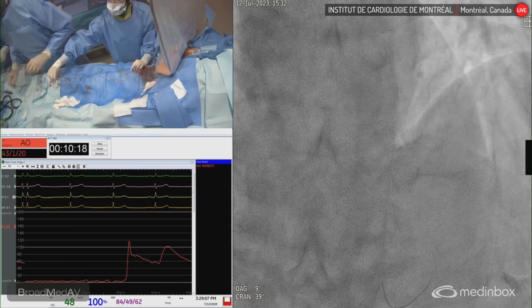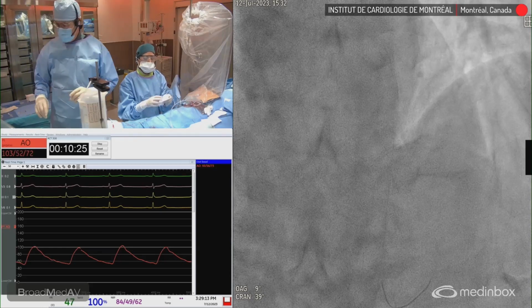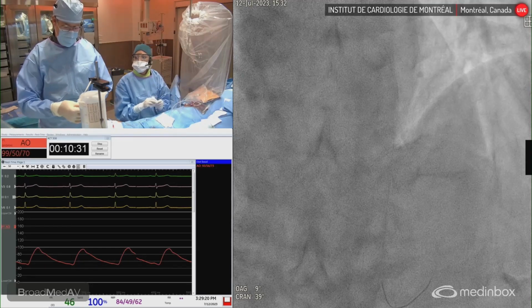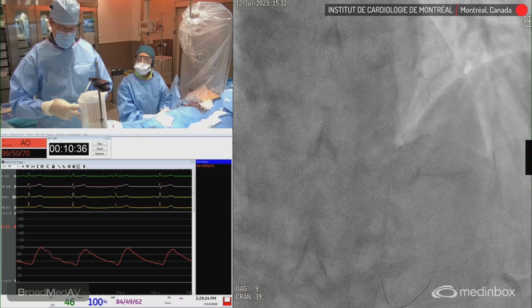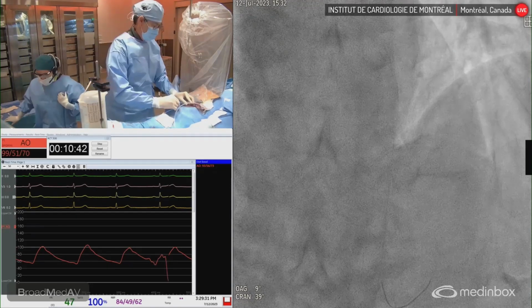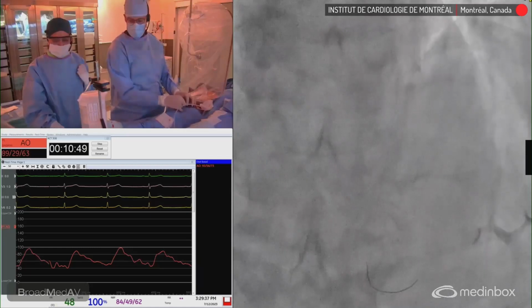Okay, let's prendre l'autre BMW, s'il vous plaît. We're going to protect the diagonal now because we're planning on inflating balloons now. Mettre le Y dessus, s'il vous plaît. Ouais. Je te place. Oui, bien sûr. Un peu de cœur là-dessus, s'il vous plaît.